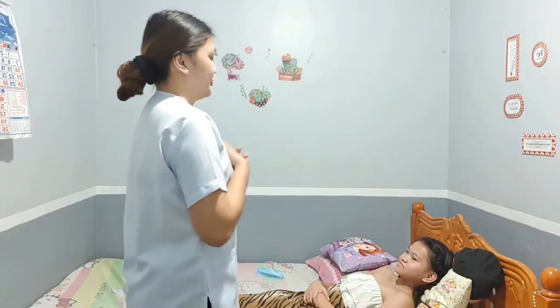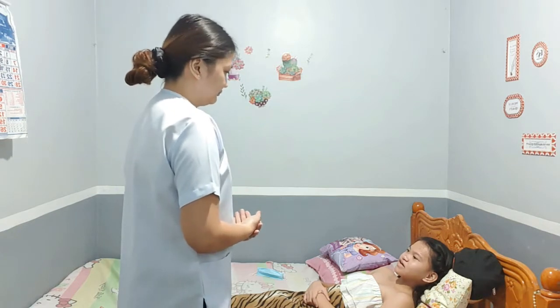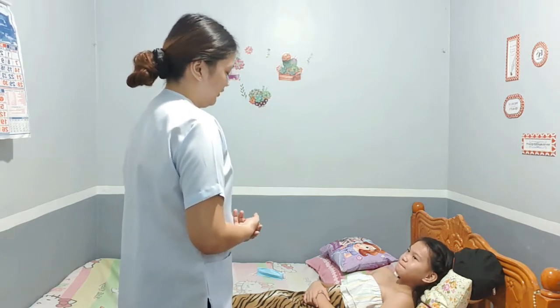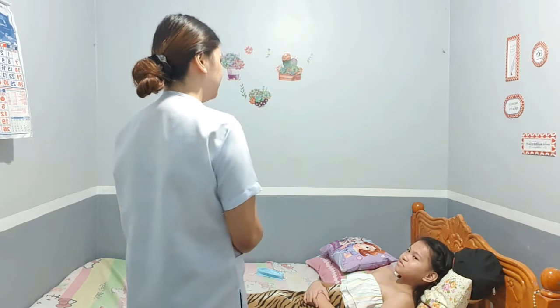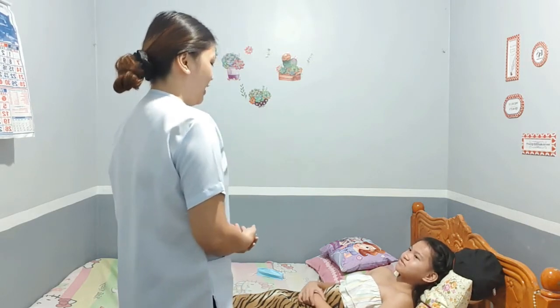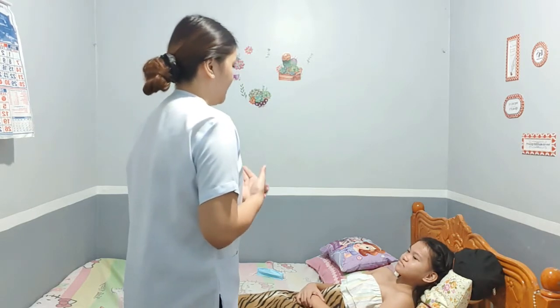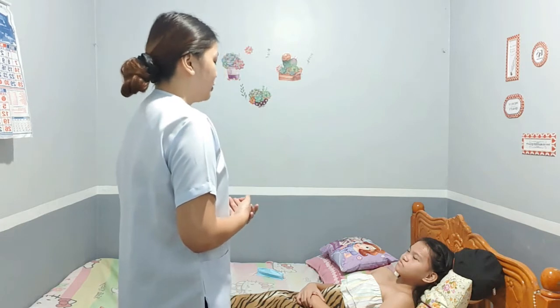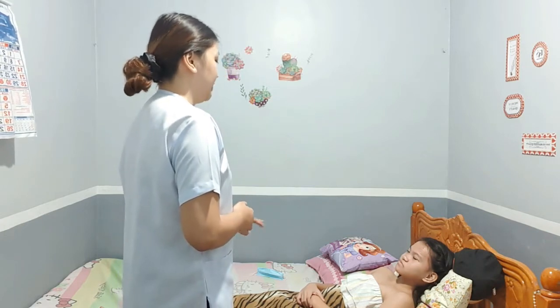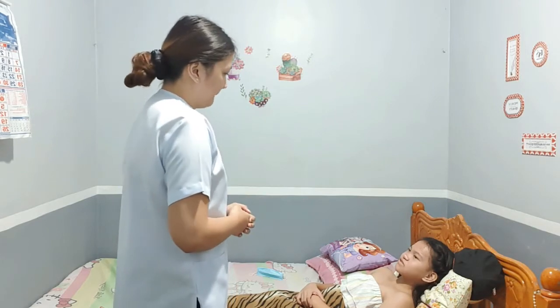So I'm going to introduce myself to my client and explain the procedure. Good day, ma'am. I am your student nurse, Marmarta Villas. May I know your full name, ma'am? When is your birthday? January 2011. Your age? So for today, ma'am, the doctor ordered you to have a catheterization. I am going to insert a tube through your urethra and connect to your bladder for you to excrete your urine. Would that be okay with you? Yes.